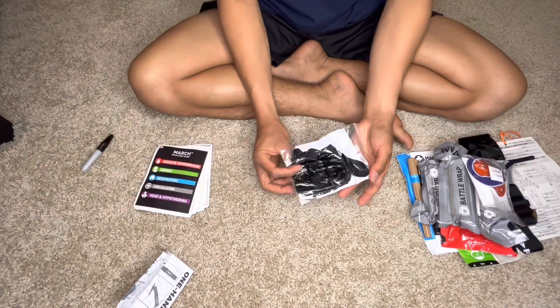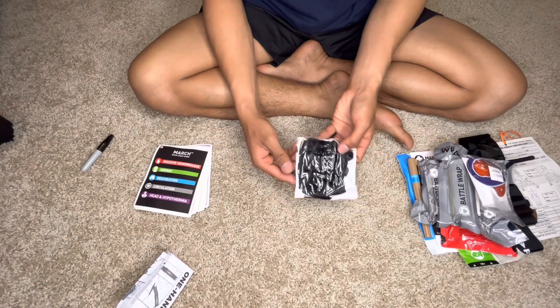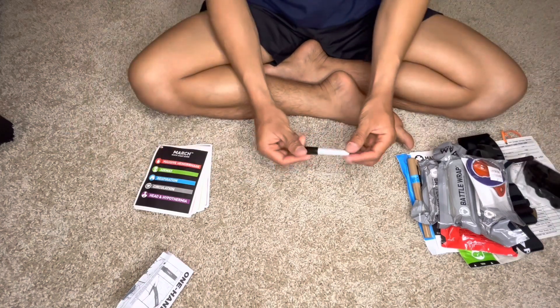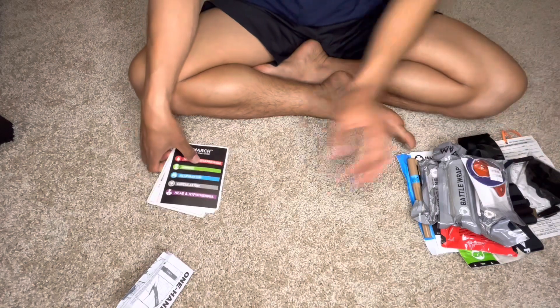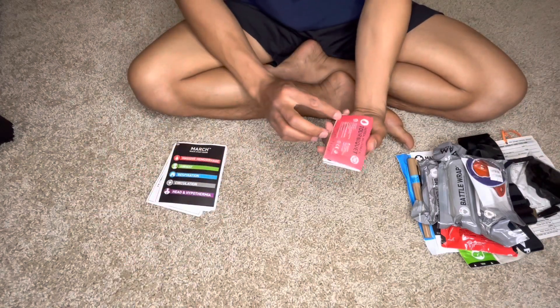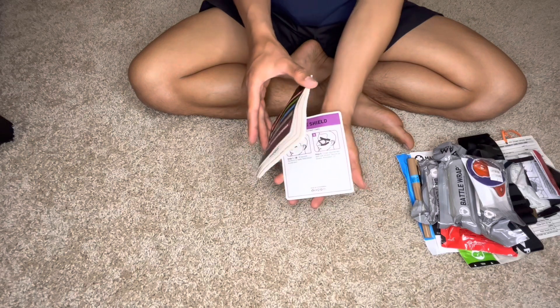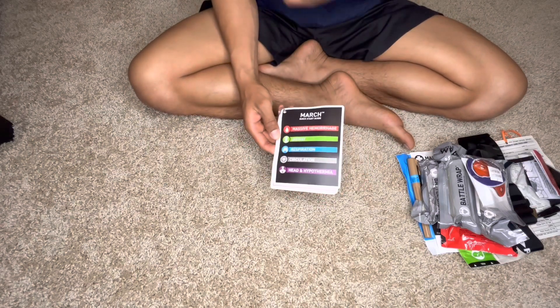Then we have gloves — it's only one pair, and they're actually pretty cool because the color is black. And then we have a Sharpie, and some information about the tourniquet and how to apply it. And that's what's inside an individual first aid kit.